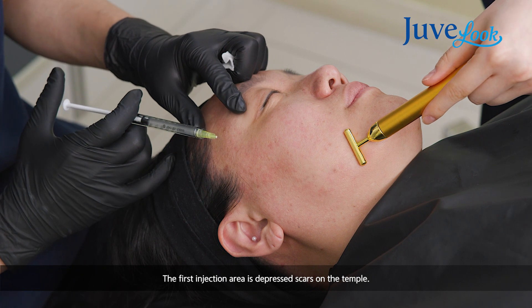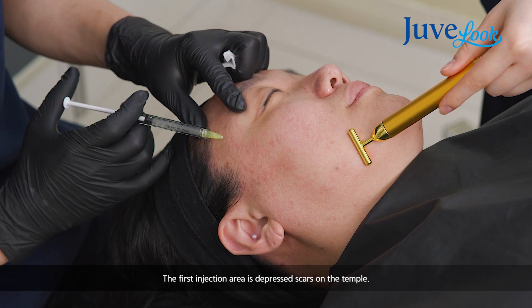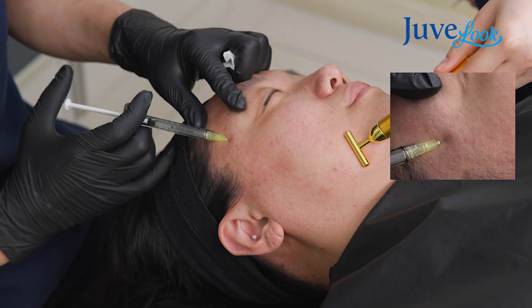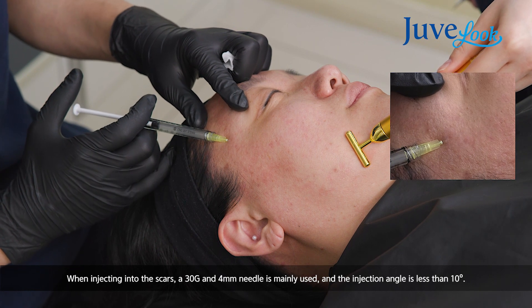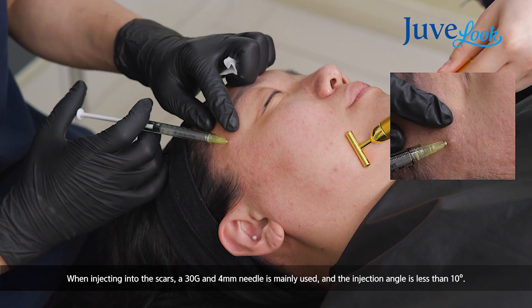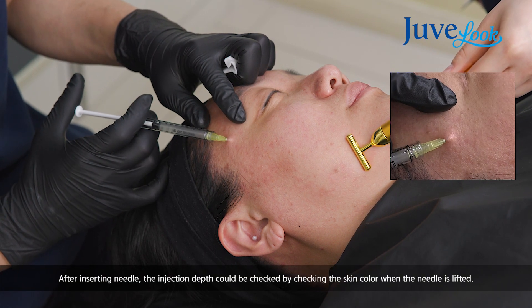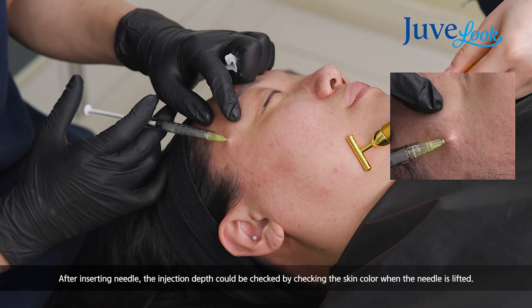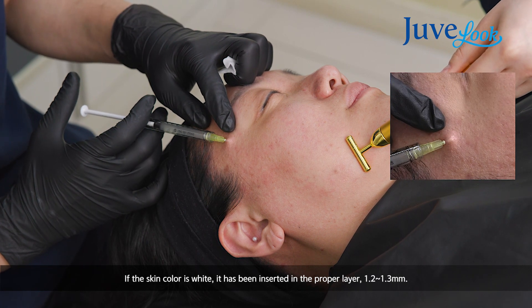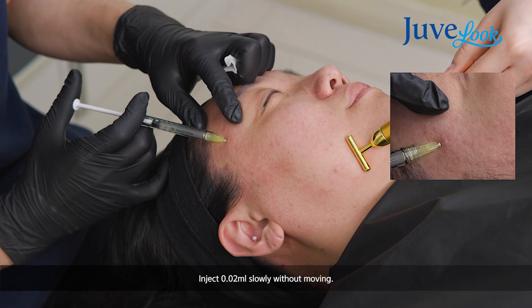I will start on her temple area — she has a few depressed scars. When injecting on the scar, I'm using a 30 gauge needle with 4 mm length, approaching at less than 10 degrees from the skin surface. I insert the full needle and lift it to check the skin color. The skin color becomes a little whitish — this is the good, right layer. I inject very slowly without moving my needle.